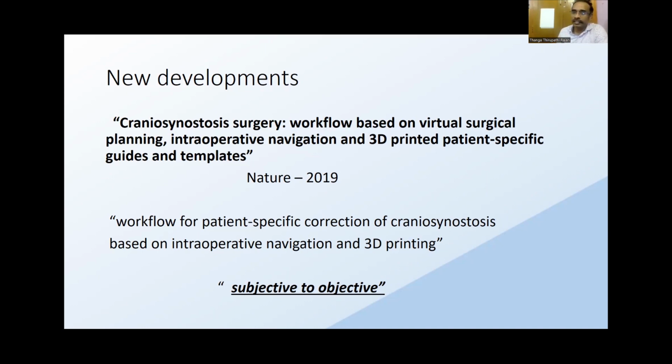In this paper in Nature, a whole list of surgeons were involved, including some 15 neurosurgeons. They did a combined 3D printing and neuronavigation approach, individualized for each patient. They calculated millimeters, did a preoperative CT scan, did 3D modeling, and then all of them sat together and built a workflow where, before surgery, they printed a specific implant template for each patient, and then did the surgery. And this changed the correction from subjective to objective.